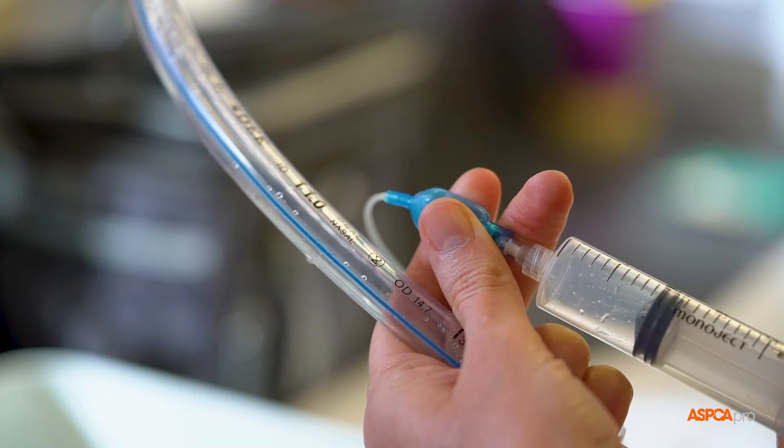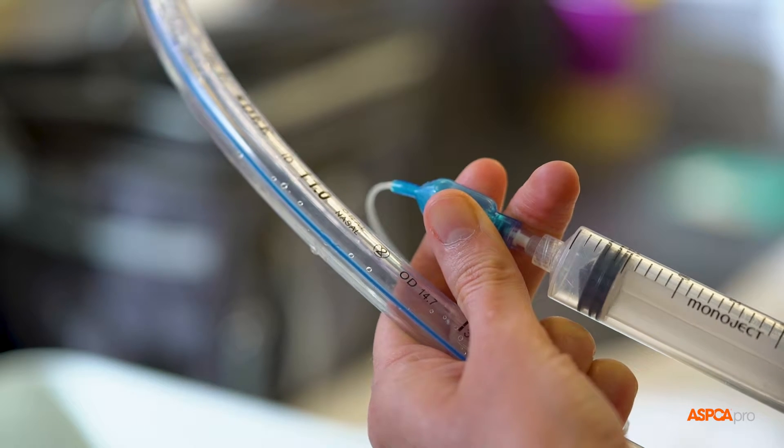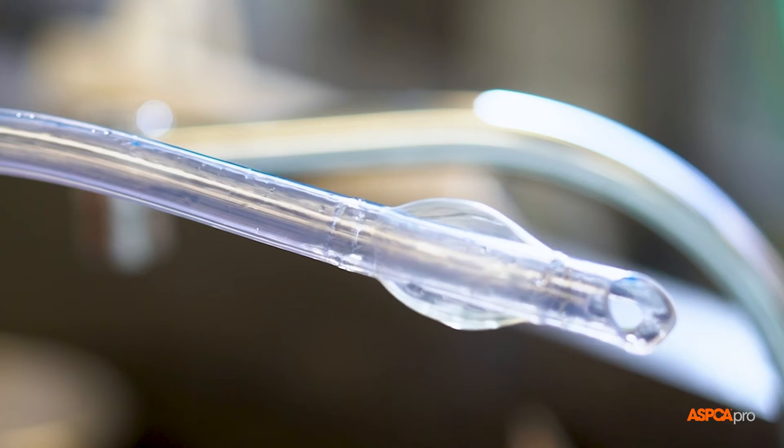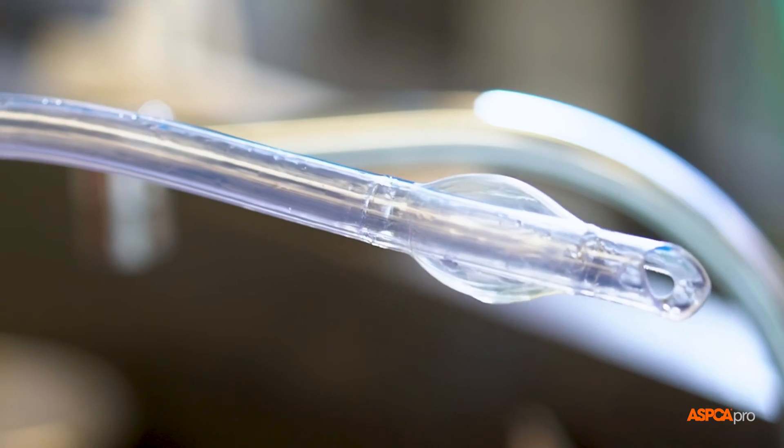To clean an endotracheal tube, first inflate each cuff just enough to remove any creases, being careful not to over-inflate, which can stress the plastic cuff.